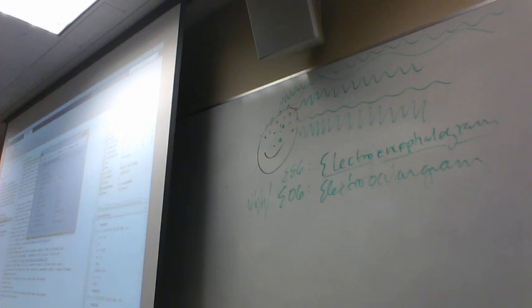It turns out most of our lights and computer screens are very specific with what we call line noise at 60 hertz. So when you plot, let's say that we graph this way, frequency. What's our measure for frequency?